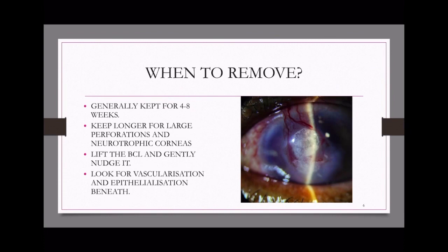It is important to know when to remove the tissue adhesive. Generally it is kept for 4 to 8 weeks. It should be kept longer for large perforations and neurotrophic corneas as they heal slowly.